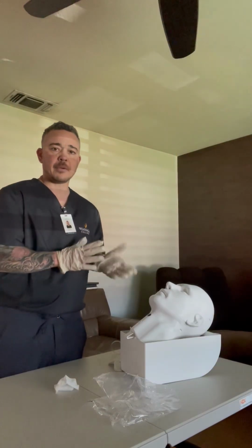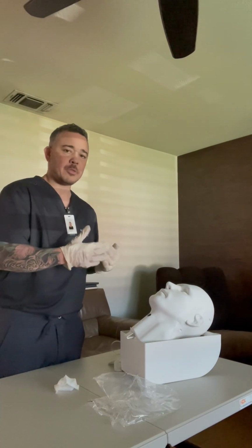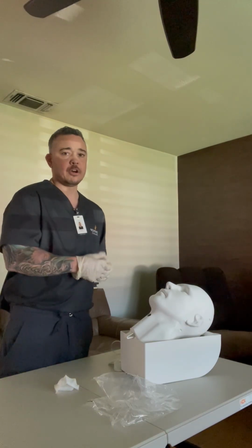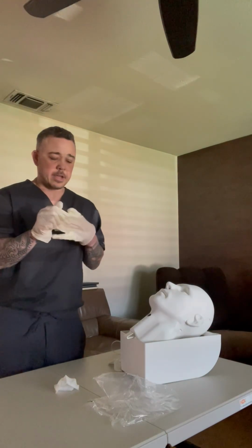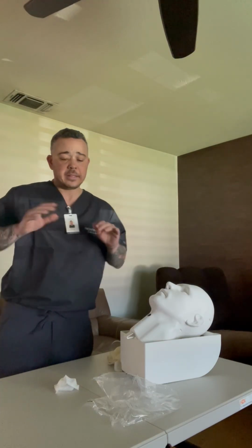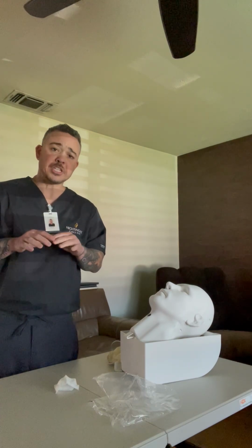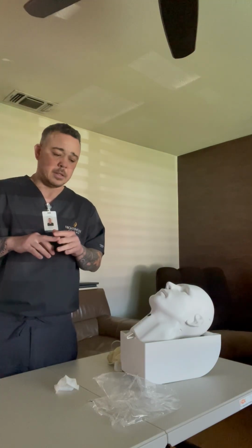I make sure I put the patient up in an upright, comfortable position, ask if there's anything else that he needs, and just let him know that I'm done with this portion. And then I would provide a call light and let the patient know there's a call light here if you need anything. And then from there, I would take my gloves off, okay? And then make sure I put this in the proper receptacle, do proper hand hygiene, and then I would document exactly what happened with the whole oxygen administration and what the doctor has prescribed from the nasal cannula to the non-rebreather mask. And then that's it. Great, thank you.